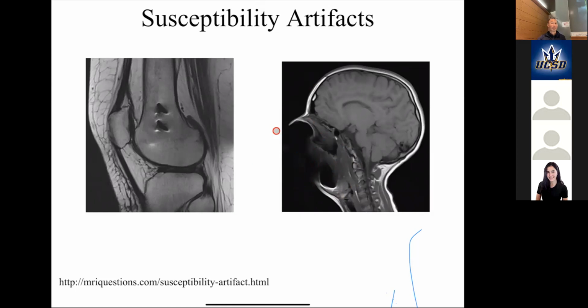Something in their teeth, right? Maybe braces, right? This is probably a young person who has lots of braces or lots of dental work. So this is one of the contraindications, or, when we scan people for research studies, we always need to know how much dental work they have, because if you have a lot of dental work, guess what?